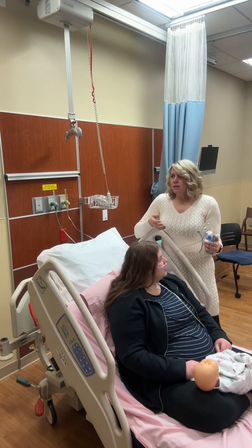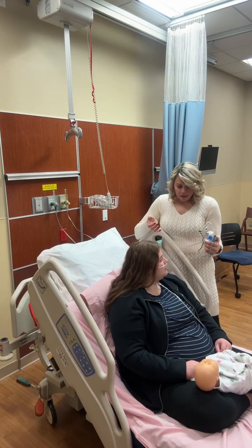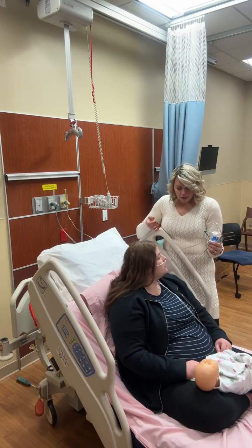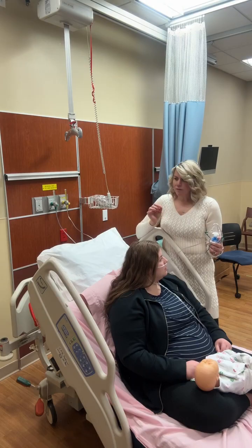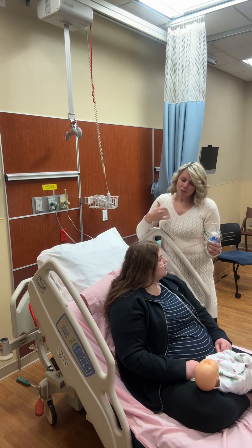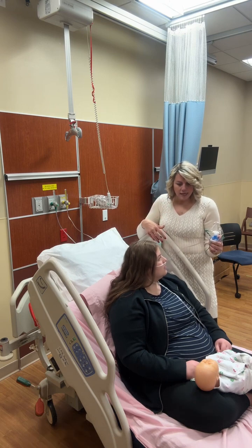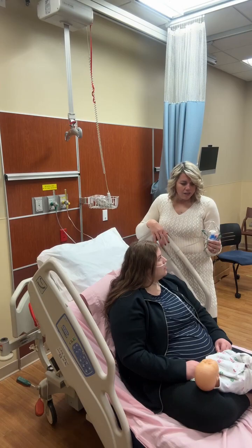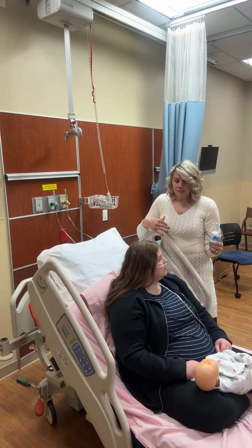The medication is albuterol, so typically there are side effects to all medication, and this medication can make you feel jittery, it can increase your heart rate, it can give you a headache, it can make you feel a little dizzy, and it can give you dry mouth. If you start feeling those side effects, please just keep me informed. I'm going to be here with you the whole time, assessing you. I'm going to check your vital signs before and after. I'm going to listen to your lungs before and after to see if it's working. And in any situation, just let me know if you need to stop.